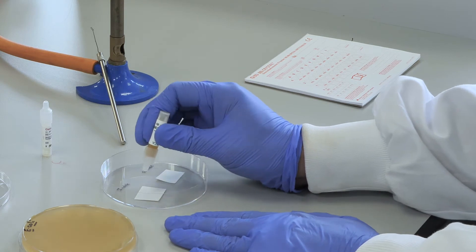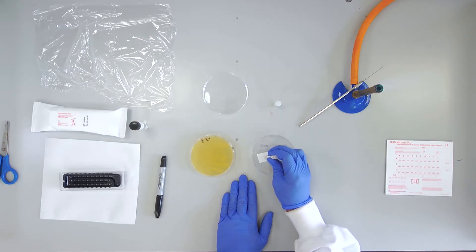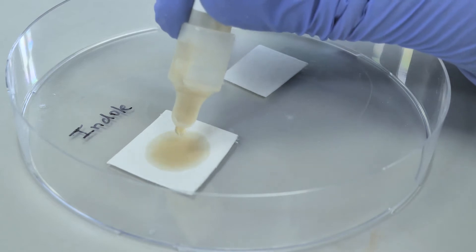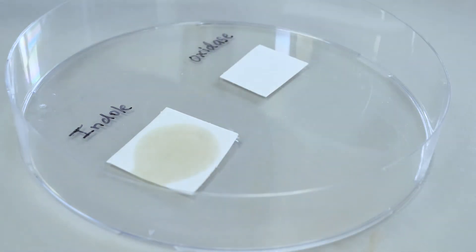In a petri dish containing two pieces of filter paper and a few drops of the Indole test vial on the centre of the first piece of paper.